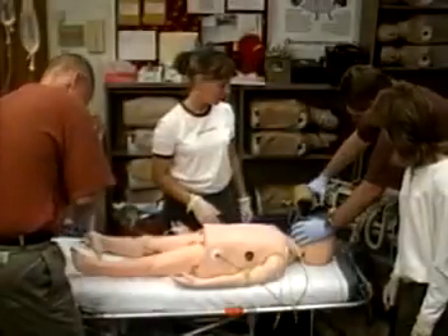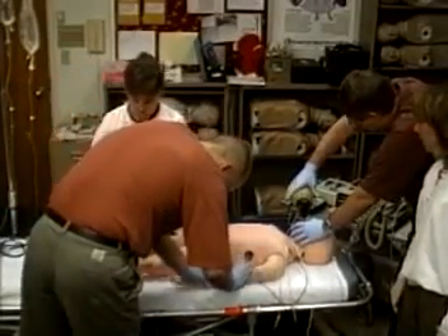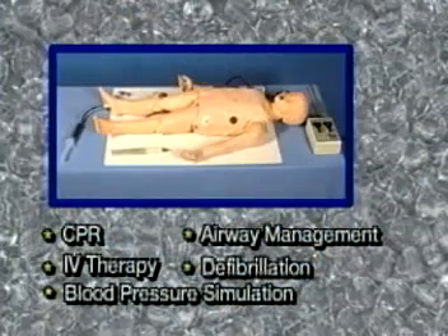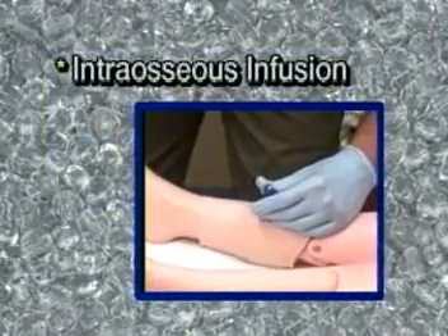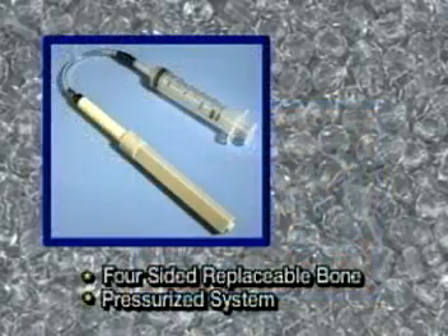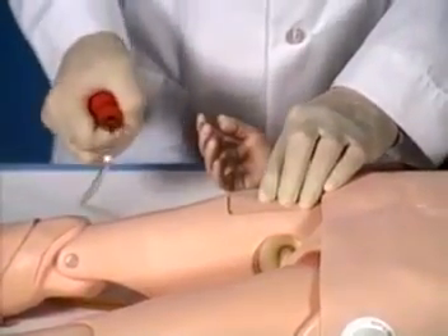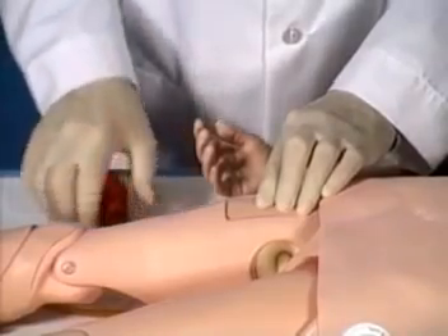In addition to the adult crisis mannequins, LifeForm has also developed a child crisis mannequin representing a five-year-old child. The child version allows you to perform all the same procedures as the adult crisis mannequin, plus intraosseous infusion and femoral access. For the intraosseous infusion feature, there is a pressurized system to allow aspiration of fluid, plus a four-sided replaceable bone. Femoral access features include palpable arterial pulse, realistic flashback from the pressurized venous system, and replaceable injection pad.